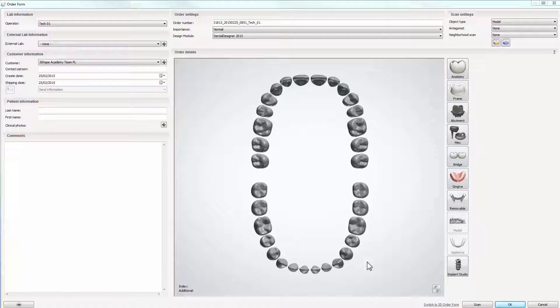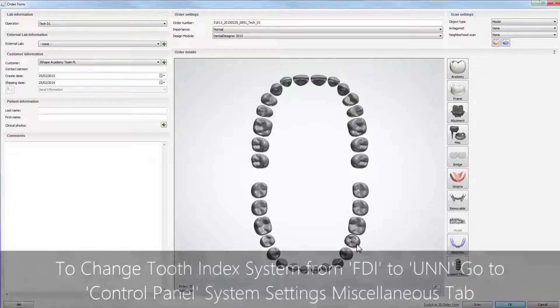In this video we will show you how to design a customized abutment with a crown. Like in any case, start your work by creating an order.